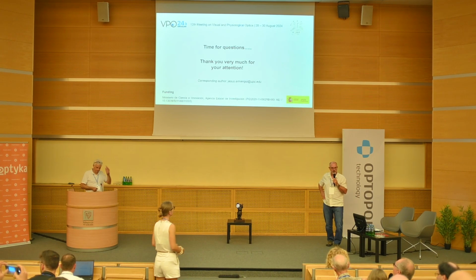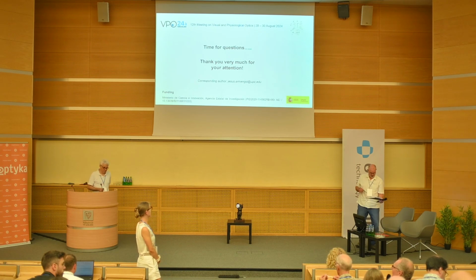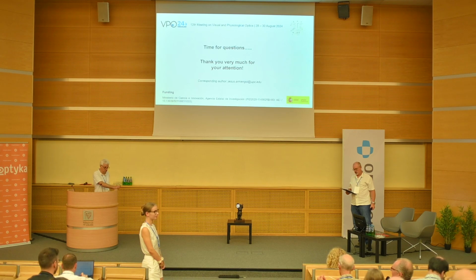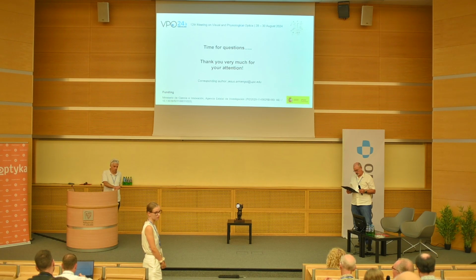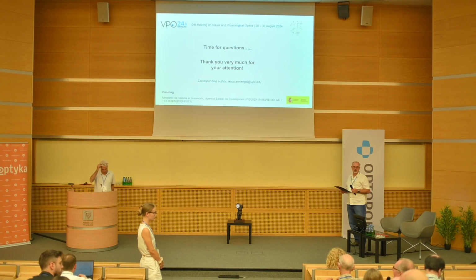So I'm a bit puzzled because the optical transfer function depends heavily on the phase transfer function, and the focus on modulation transfer, I think, is missing a lot of the visual information that you could be obtaining by calculating something like the visual Strehl in the spatial domain and correcting for where the peak is located in energy. So I would encourage you to include a little bit more.